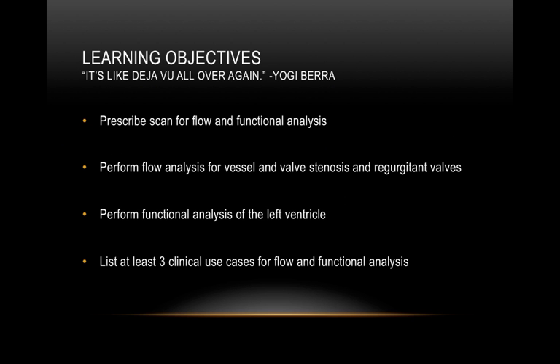So, as Yogi Berra said, it's like deja vu all over again. Here are the learning objectives, so I hope that now you can prescribe a scan, do the analysis, including the functional analysis and flow analysis, and know at least 3 clinical use case scenarios for flow and functional analysis.